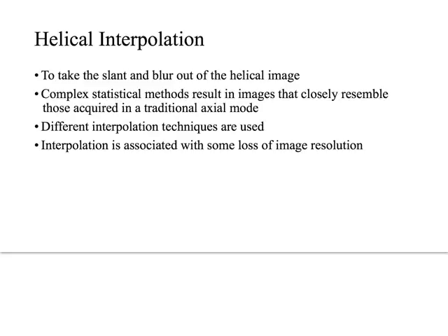The big one that we're talking about is what she calls slice thickness blooming. Now this is something where you're going to have to put on your thinking cap a little bit. There's an illustration of it on the bottom of page 52. What has happened is there is an amount of data that the machine is having to make up. And as the machine makes up that data, it's going to make the slices a little bit thicker than they actually were.